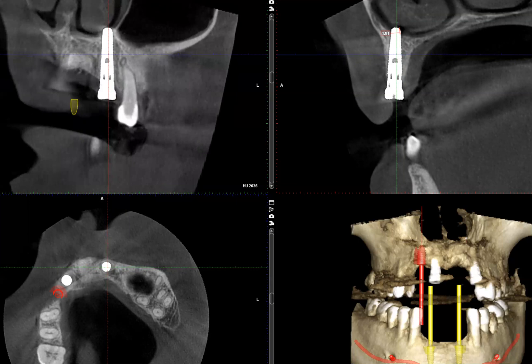Because of the unique location of where it has extended into the nasal cavity, it is at the junction of the medial wall of the sinus and the floor of the maxillary left sinus as well. If this had been tipped a little bit more distally, this implant could have also went into the maxillary sinus.